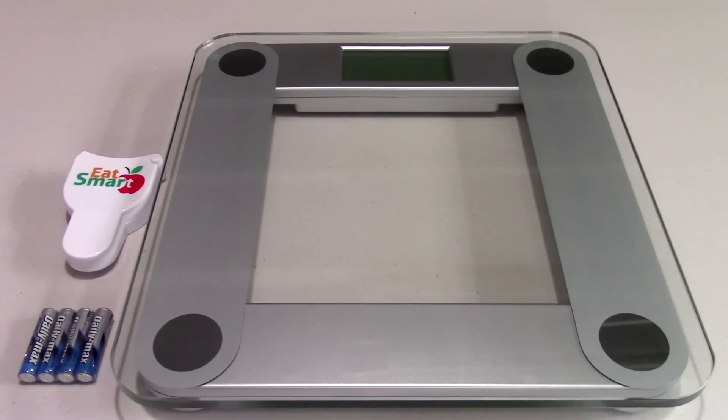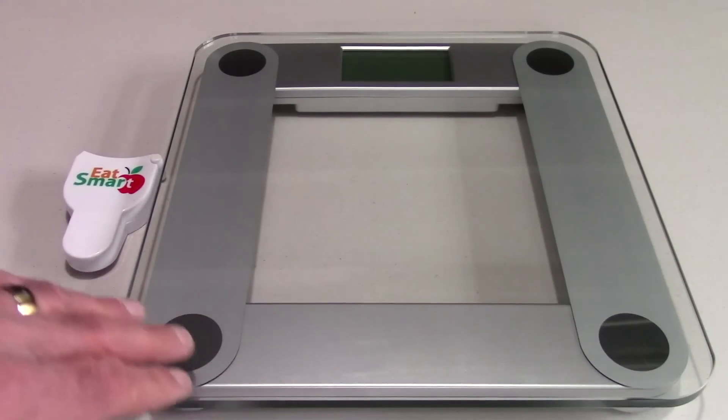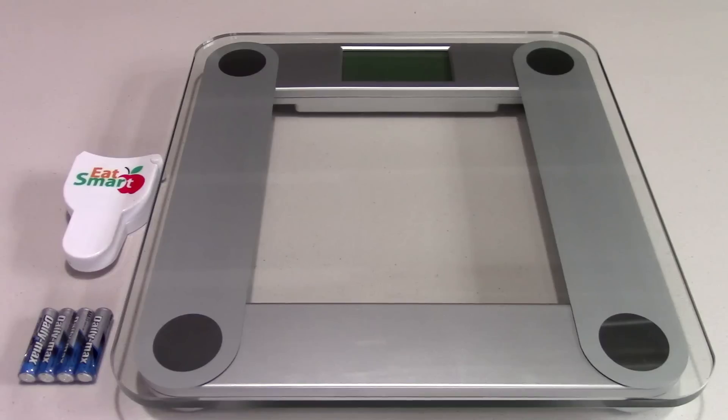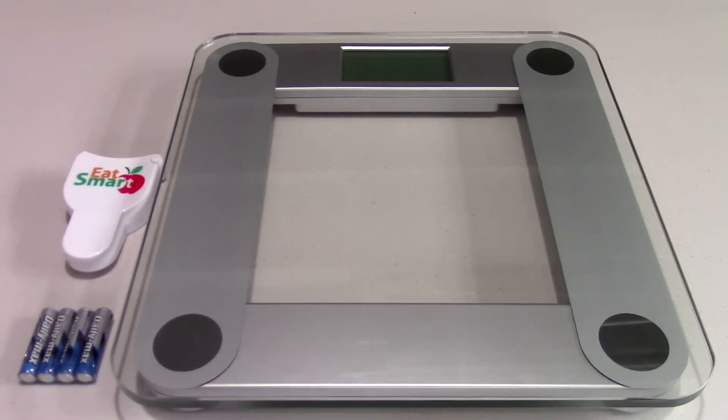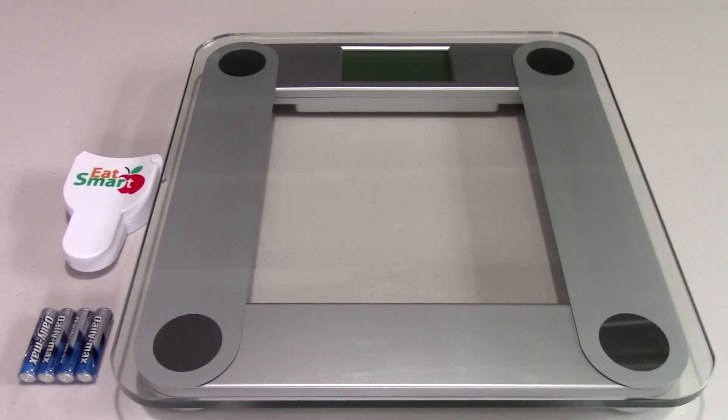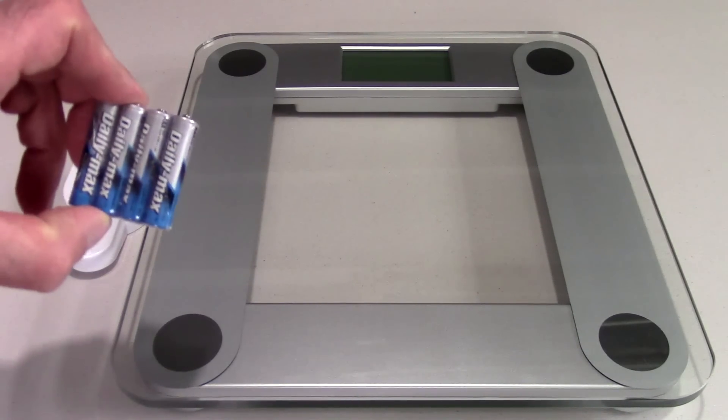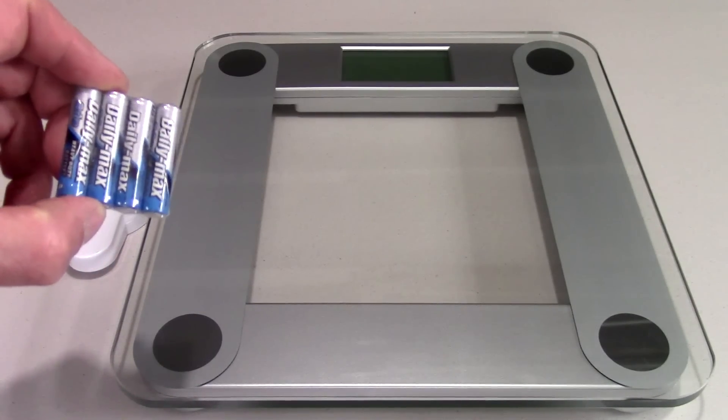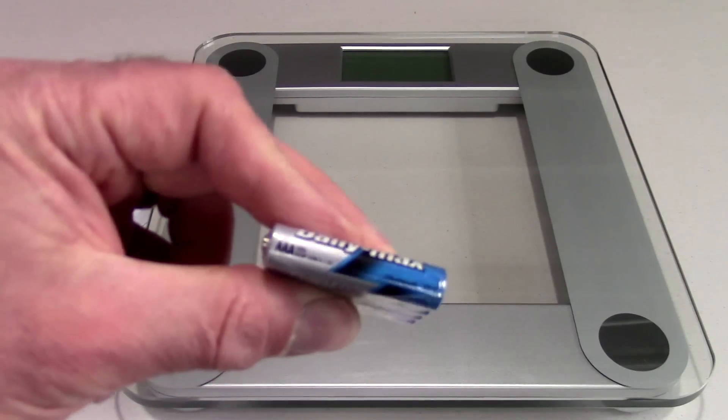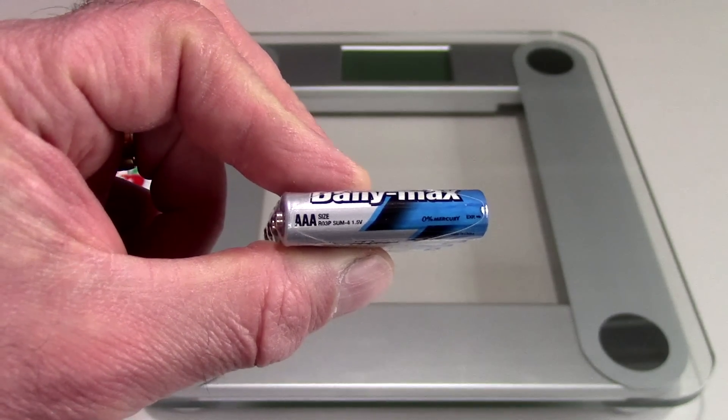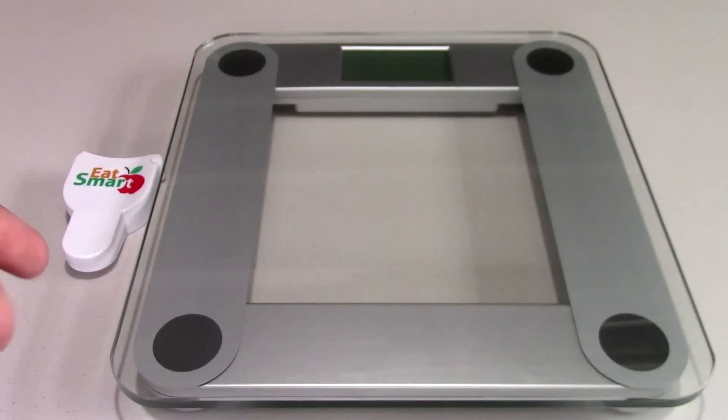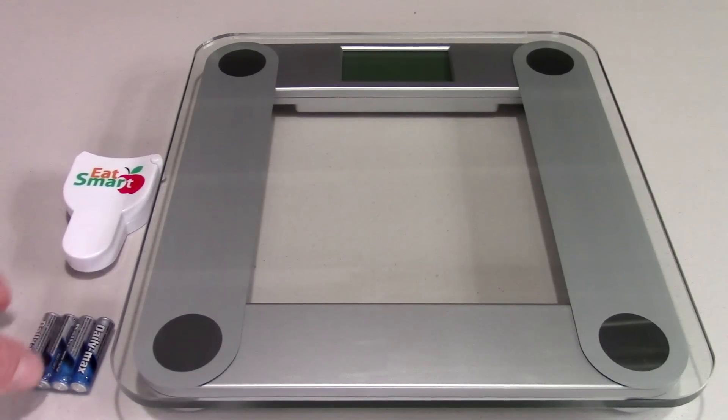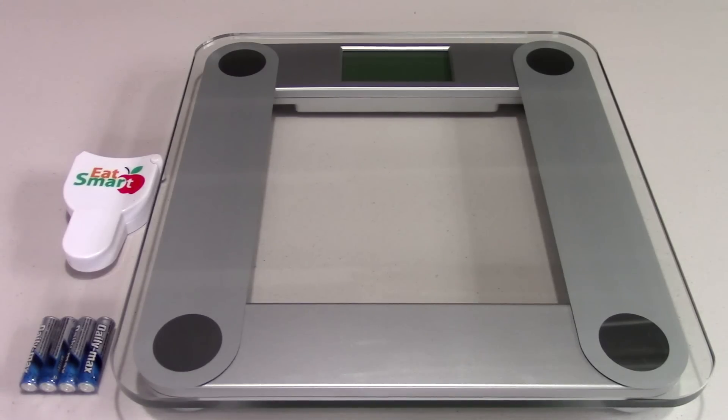As you can see, the scale is glass, which makes it kind of difficult to get a good angle with the lighting because it wants to reflect. But also in the package, what you get with this are four batteries. These are AAA batteries, which is kind of nice. You get an electronic device and you don't have to go running out to the store and buy batteries.